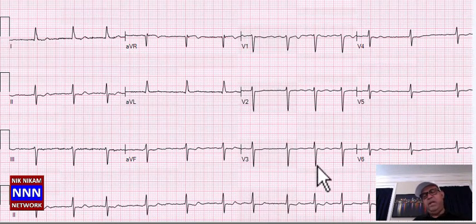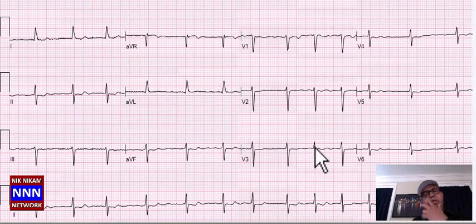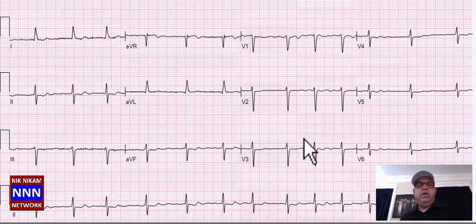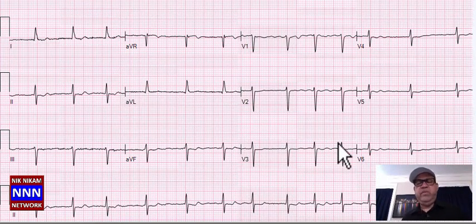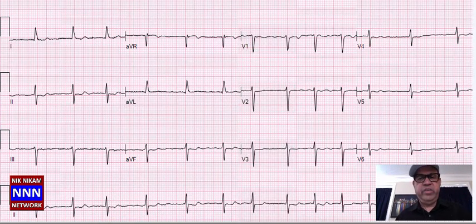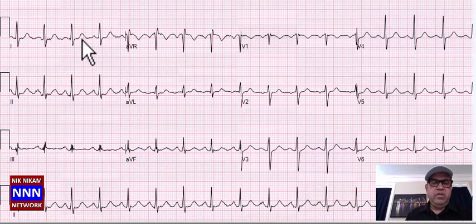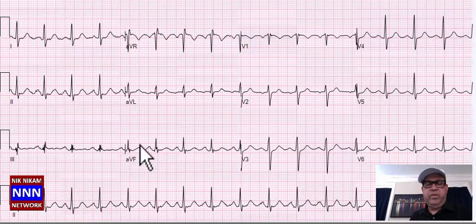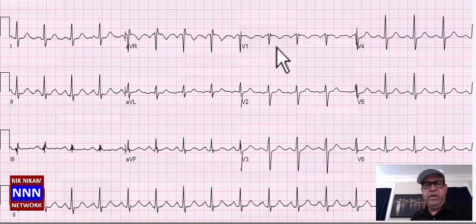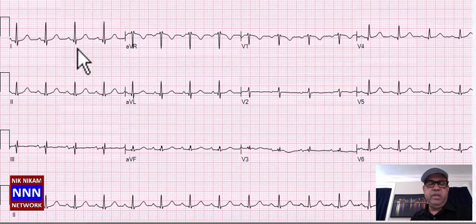Sinus rhythm with non-specific T-wave changes. Sinus rhythm, non-specific ST-T changes inferiorly and anteriorly — diffuse non-specific ST-T changes. Here: diffuse non-specific ST-T changes. Sinus rhythm, T-waves okay, QRS okay in the inferior leads, anteriorly they look all right.